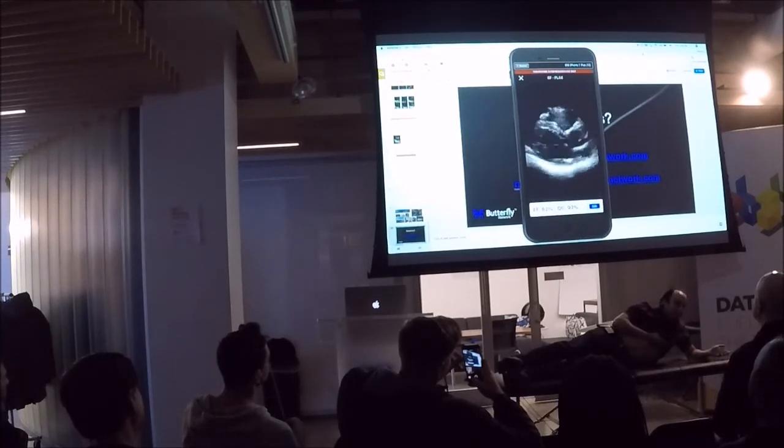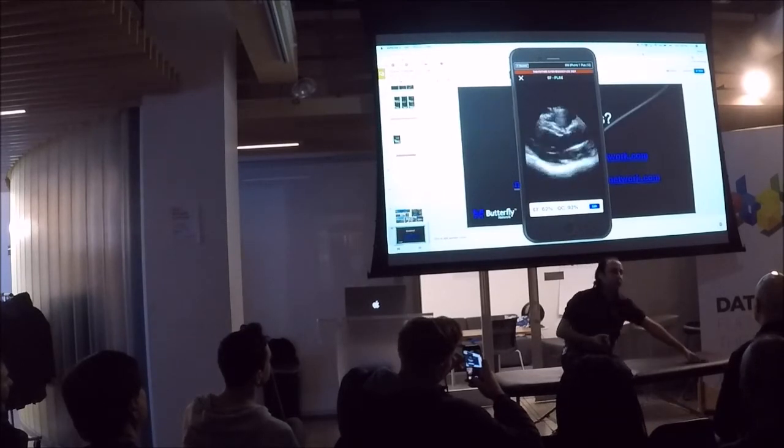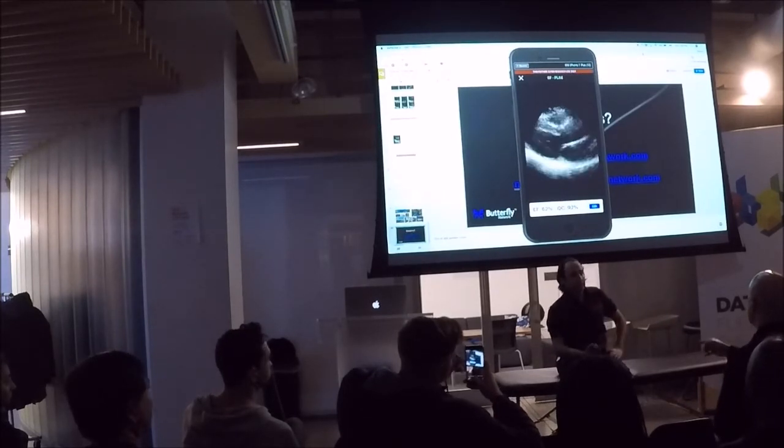And right there on device in real time, I've computed my ejection fraction, which is 62. It's a very healthy percentage. And the quality indicator here is a 92, so it tells a clinician that image was good enough to be trusted.